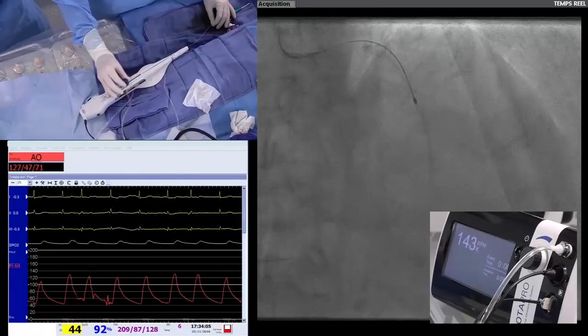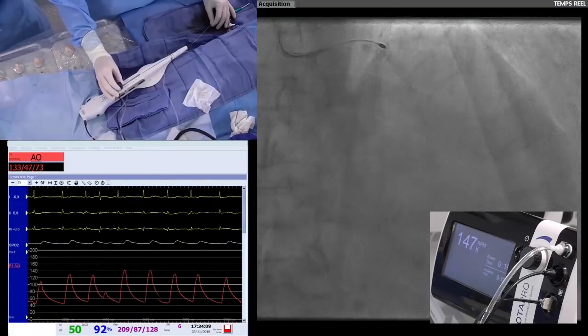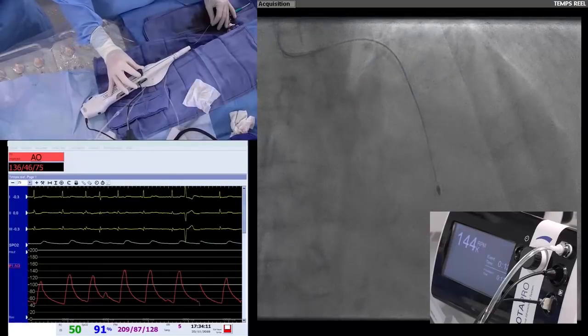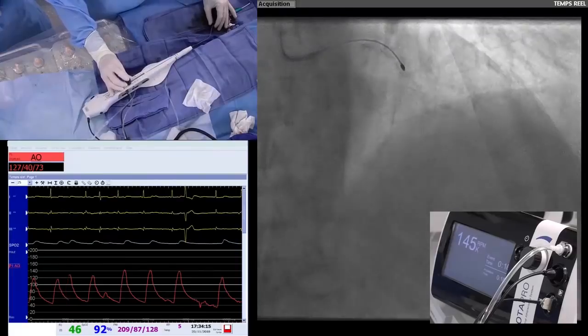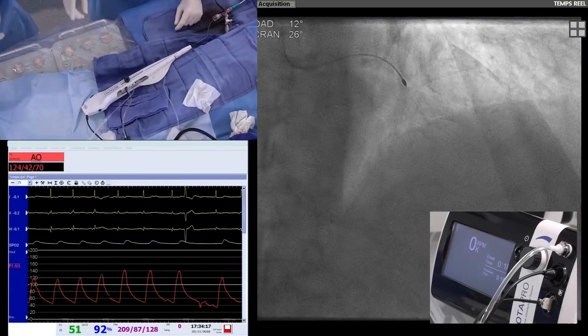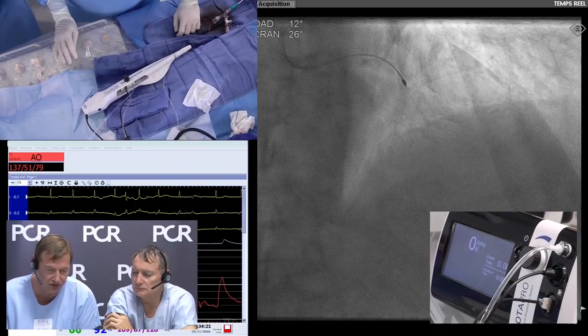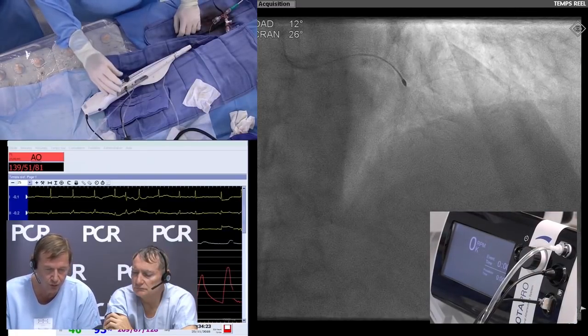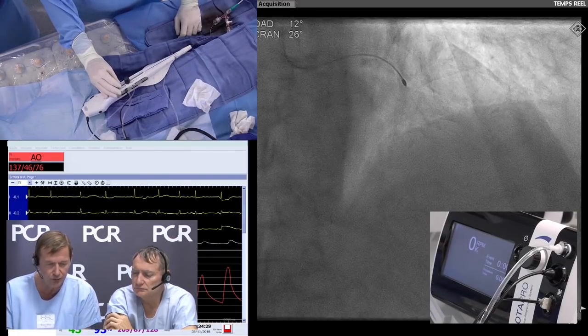Do you recommend Rotaglide for the ROTAPRO system? Well, that's no longer available to us. It did make it very useful, I have to say, when we had it available. When changing burrs, do you need a new drive unit? No, the exchange mechanism for changing the burrs is exactly the same as the old system. So you keep the same drive unit throughout your case, even if you want to change 2 or 3 burrs.